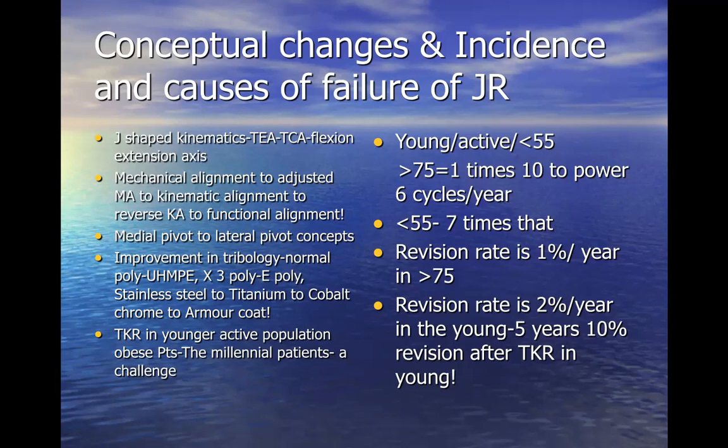There's a great debate on what is the right alignment for the knee. Is it mechanical alignment, or adjusted mechanical alignment, or kinematic alignment, or adjusted kinematic alignment, or reverse kinematic alignment, or the new kid on the block, the functional alignment? And we dealt with this in depth in my Center SSOC's 4th Meet the Master course, which is available online on Ortho TV. I refer you to this for further details. Also, we don't know if the knee pivots on a medial, that is on the MCL side, the medial pivot knees, and there are lateral pivot knees, where it pivots on the lateral complex.